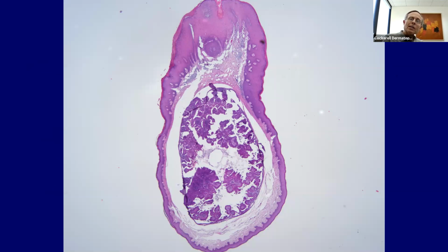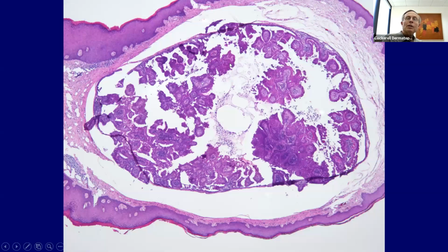This lesion was probably a little papular kind of lesion, and you've got a central neoplastic process taken from an area that's near the mucous membrane. Going to higher magnification, you can see that it's an epithelial neoplasm.